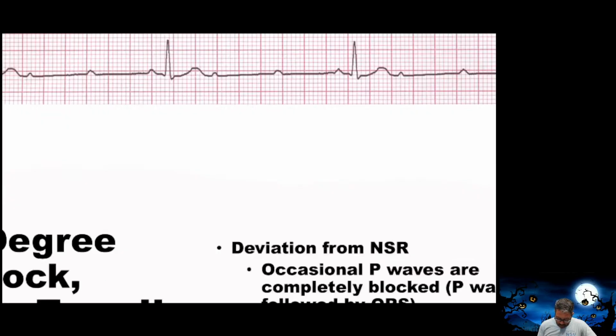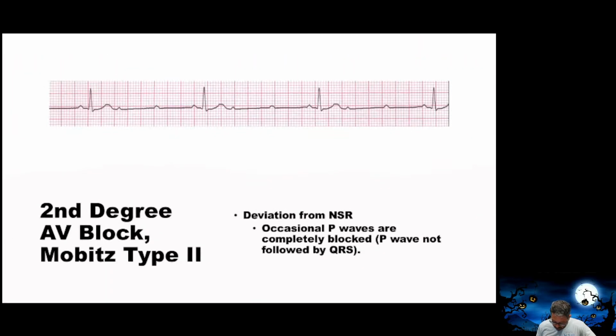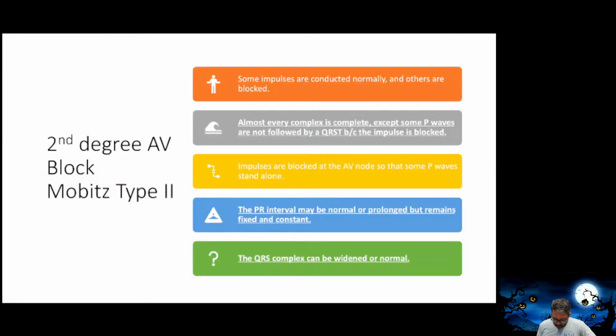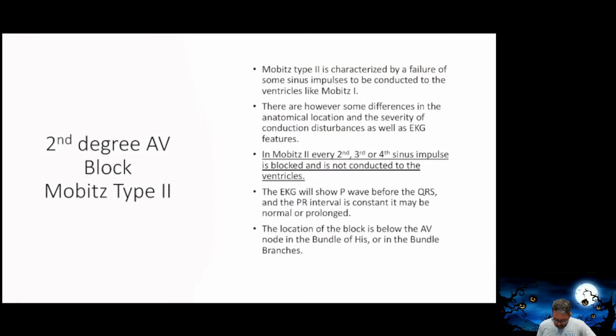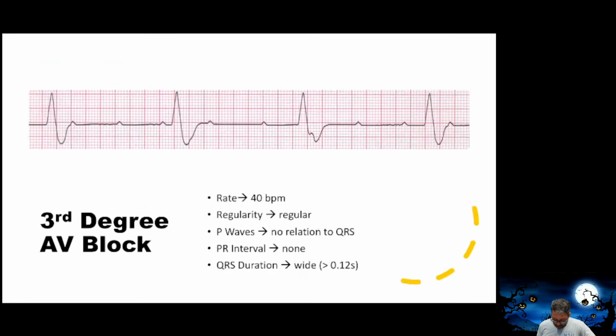Here's another one. I think it's the same picture. Okay. And here's your third degree AV block.